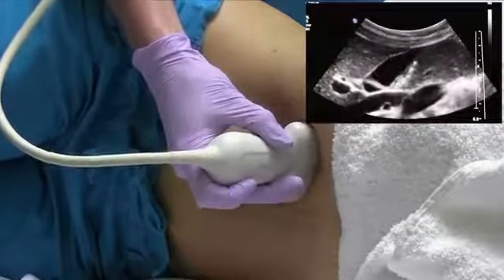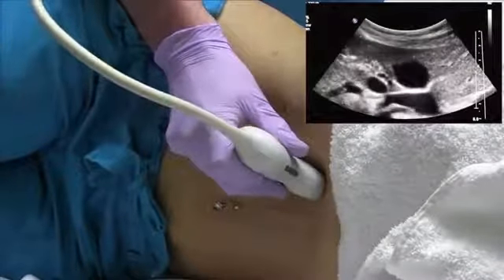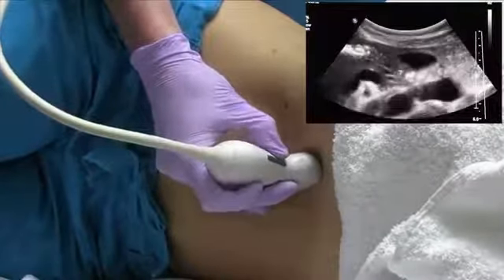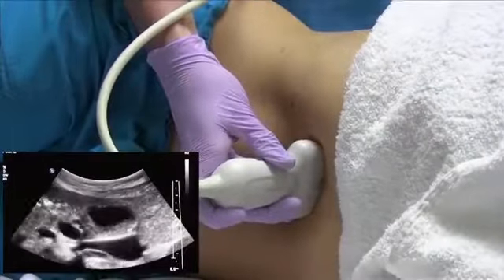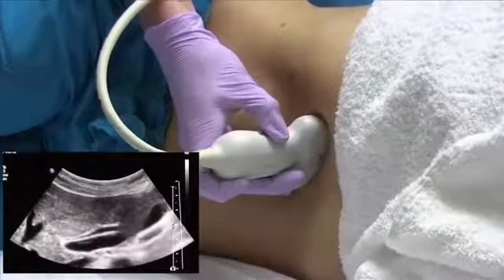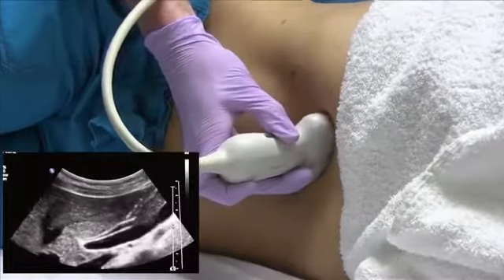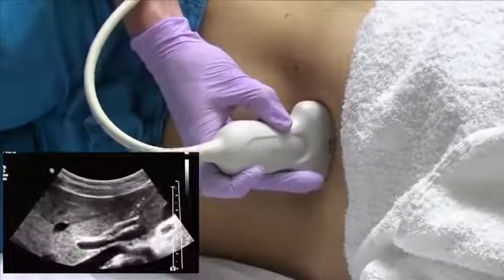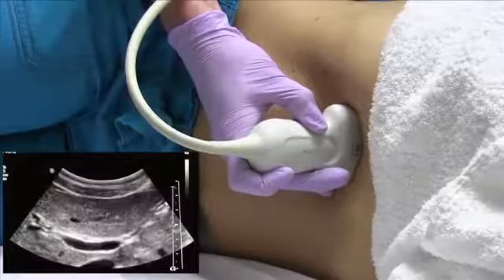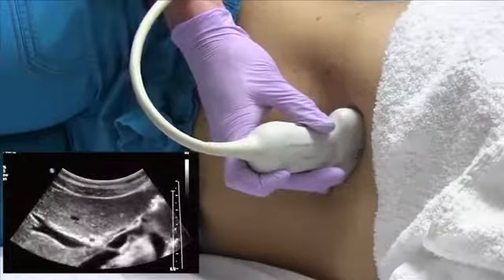Once you get your sagittal sweep, you're going to want to turn your probe 90 degrees again and sweep through in a transverse plane just to make sure you're not missing anything. You can also see the porta hepatis and the CBD from this decube position. For this, you want to elongate the main portal vein, and you'll see it track right up into the liver. Once you find that, you know that the CBD and the hepatic artery are right next to each other here.